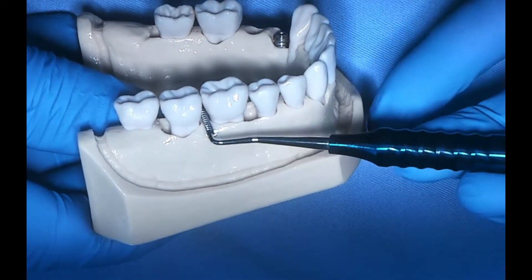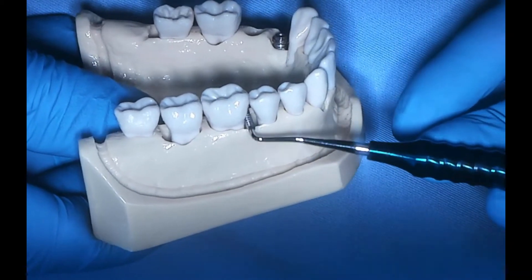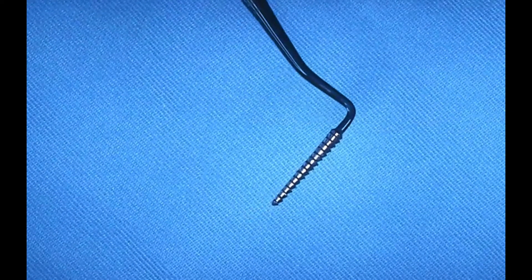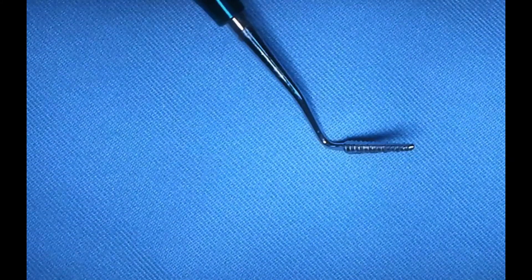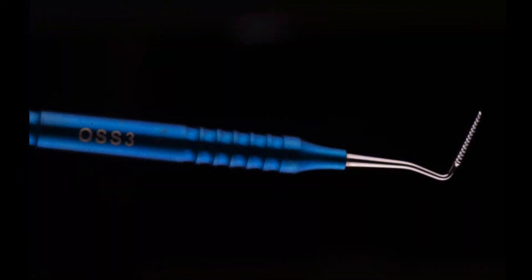You can angle it depending on the size of the embrasure. A word of caution: use it carefully because sometimes it can get wedged in between the teeth, and that can lead to a couple seconds of terror when you can't take it out — but luckily teeth have PDL, and it's quite simple to wiggle it out. It's a very critical tool in periodontal surgery and functional crown lengthening.